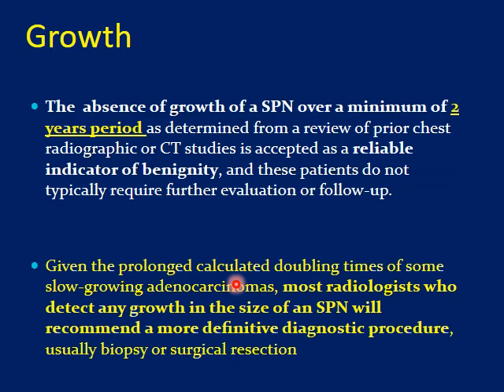Regarding the growth of the lesion, another controversy and somewhat misleading ideas. But let us simplify it. If you have a lesion that grows slowly, but not that slowly, within months, this is not a benign lesion. If you have a lesion that will grow rapidly, this is usually an inflammatory lesion. Let us read these sentences.